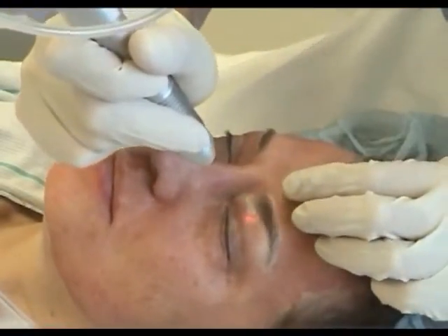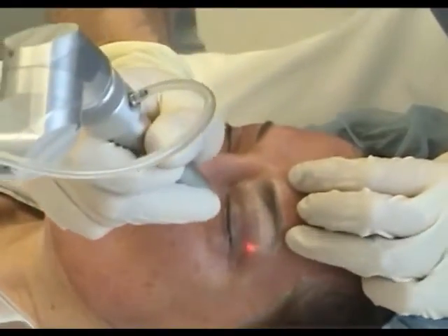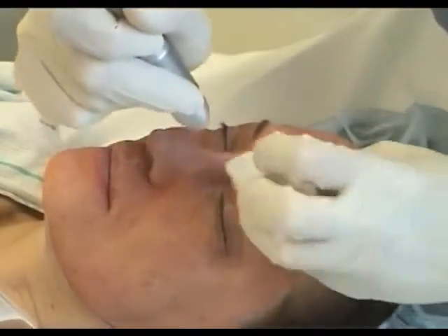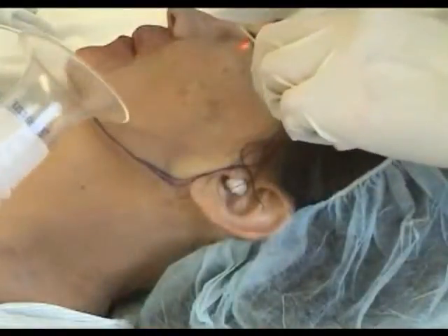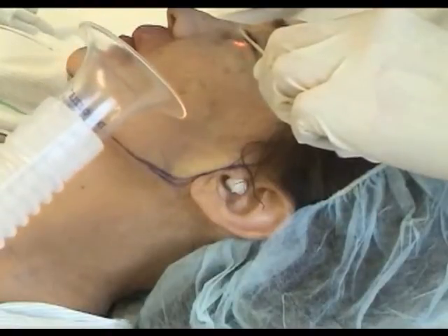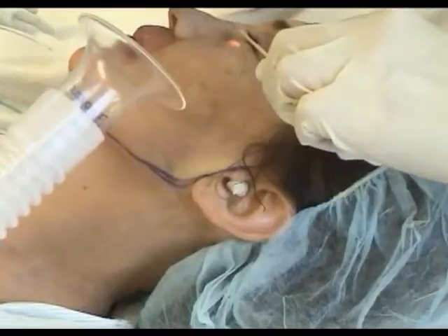After eye shields have been placed, we make a pass over the eyelids with an erbium YAG laser. Here at a setting of 10 joules per centimeter square, the eyelid is being treated with a 5mm spot size. When treating the lower eyelids, the wooden end of a Q-tip may be used to stretch the lower eyelid and keep the eyelashes out of the laser's way.